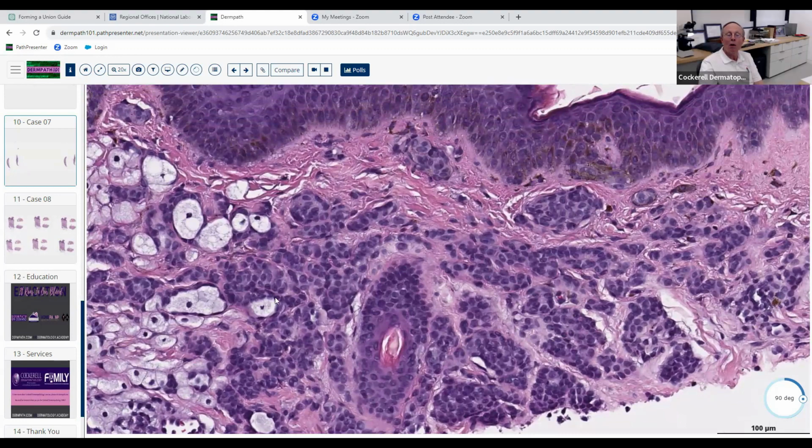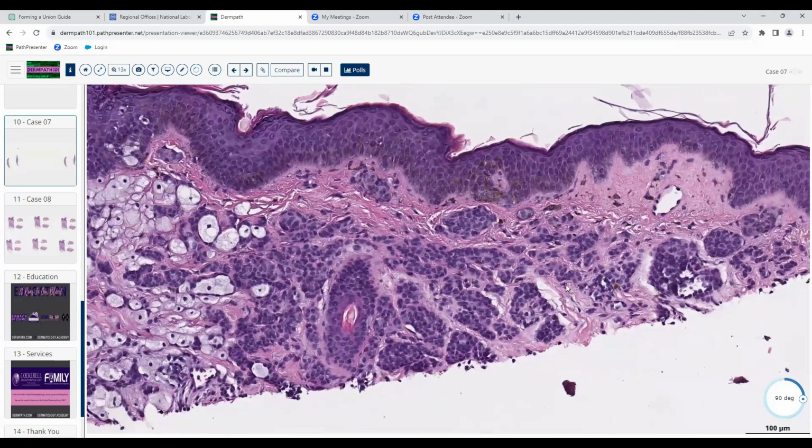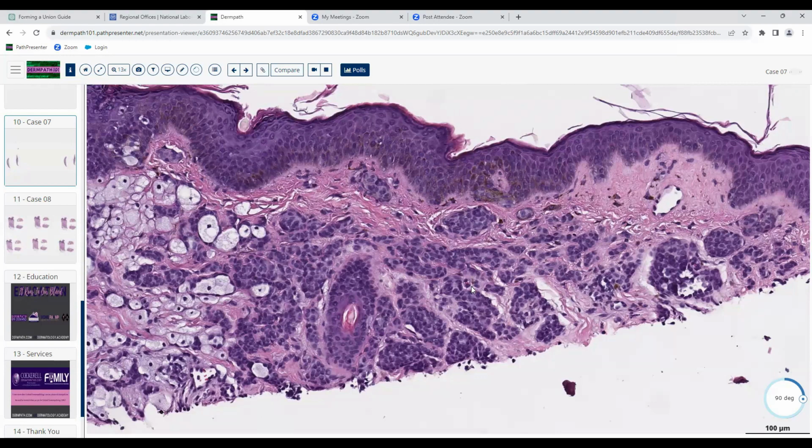So what's the diagnosis of this part? Epithelial? Well, it's a special type of epithelium. It's arranged in nests with melanin. It's not this kind of epithelium. It'd be like some kind of a gland. Well, there's no real glandular differentiation. It's arranged in nests. Hair follicle? Well, there's a hair follicle. This doesn't look like that.